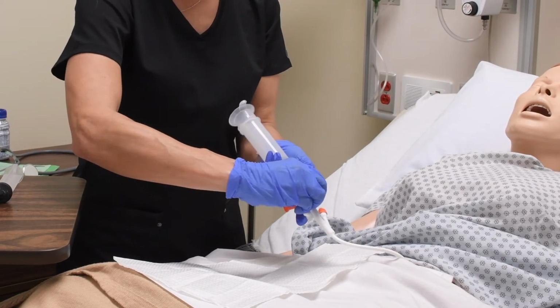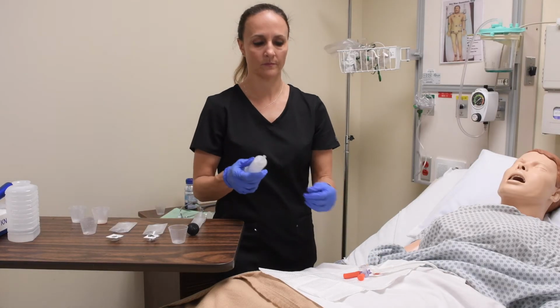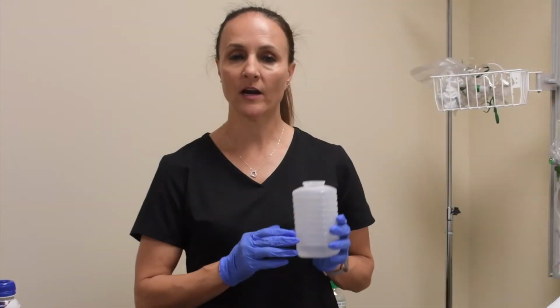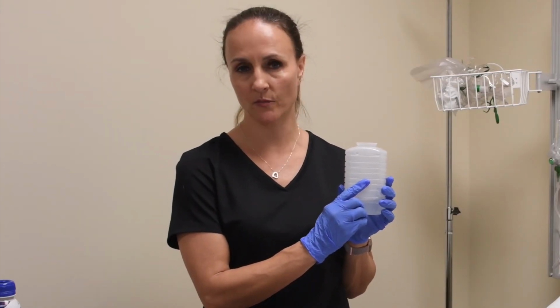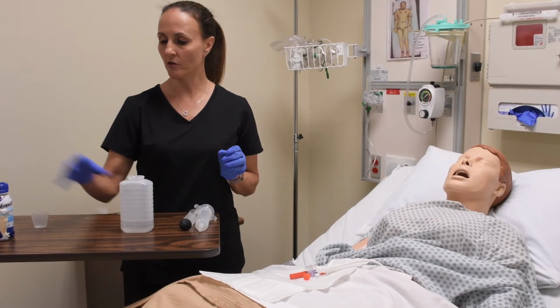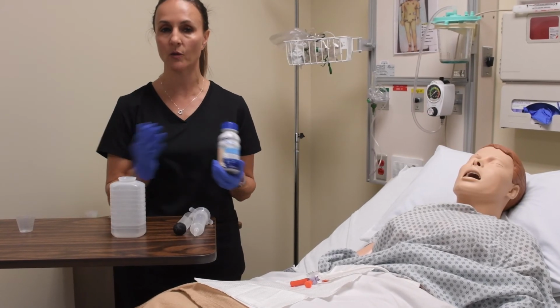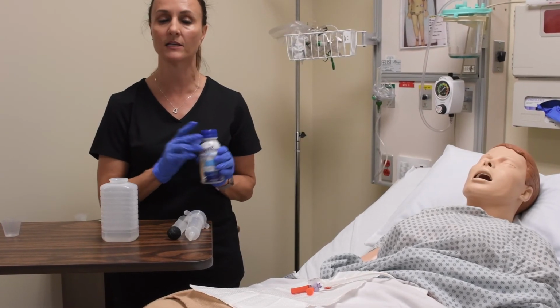Now I'm going to turn it to the off position and take off my syringe. Make sure that you close the Lopez valve at the very end. Before I began, I had pre-filled my irrigation kit with 300 mLs of the warm tepid water. Now I have 100 mLs left. That's a total of 200 mLs of water that was given with feedings and medications. Don't forget that you also had 237 mLs of the feedings that you gave. You have to combine the two together, which would be a total of 437 mLs, and that is your patient's intake.